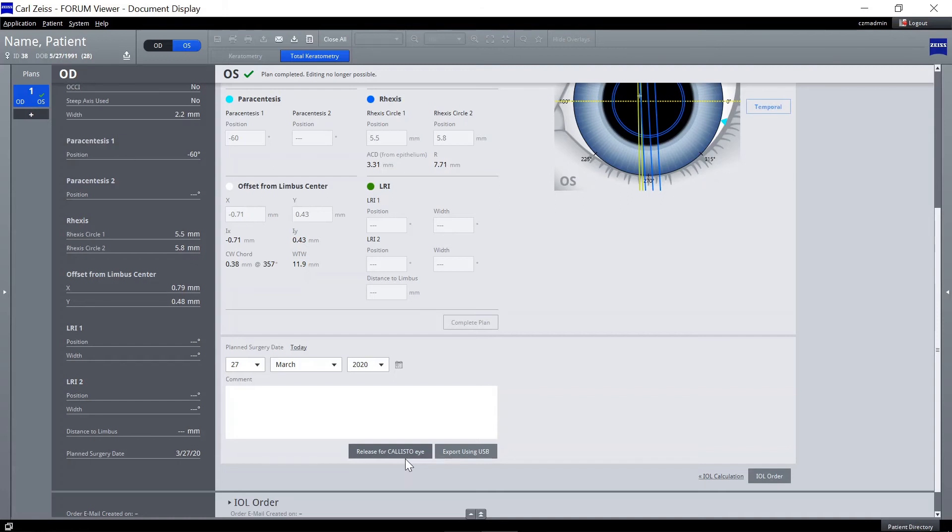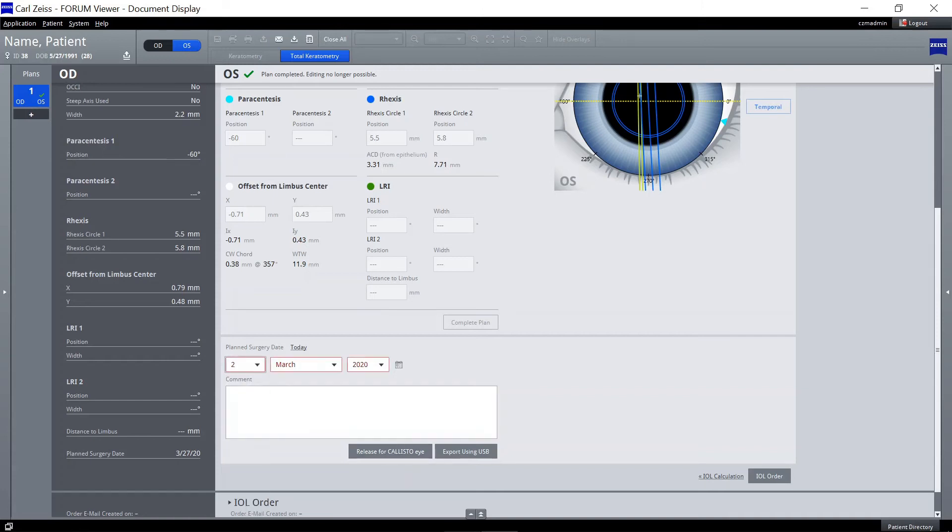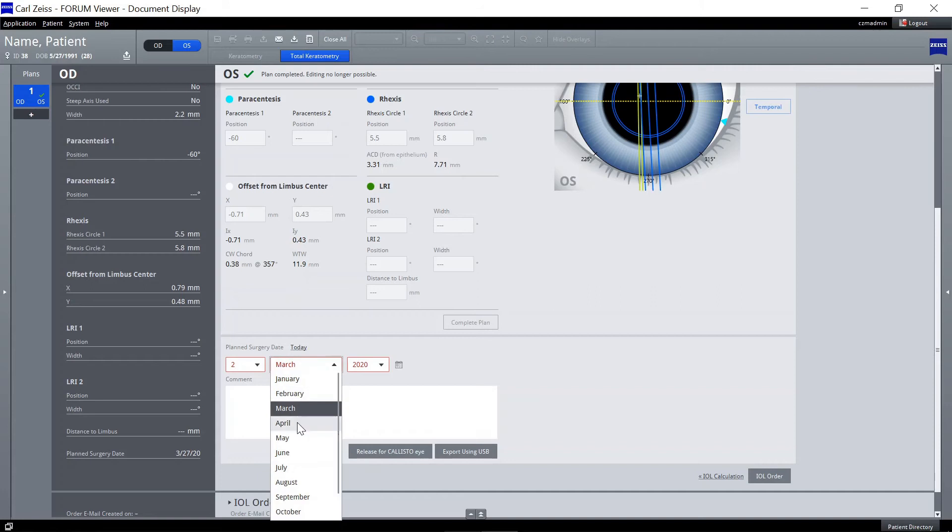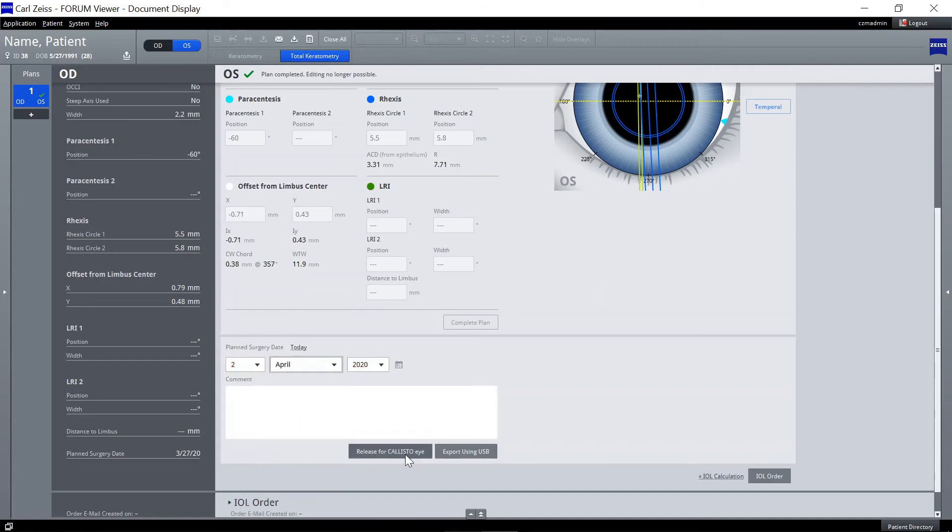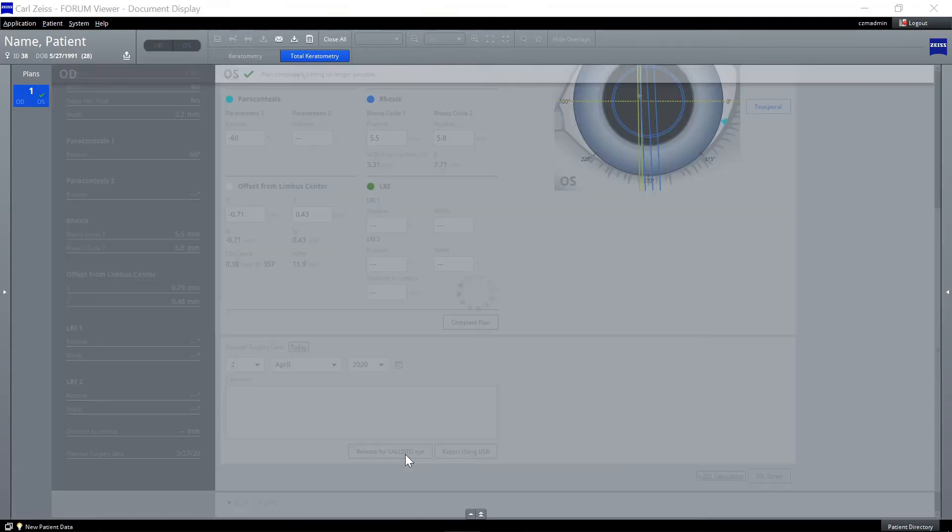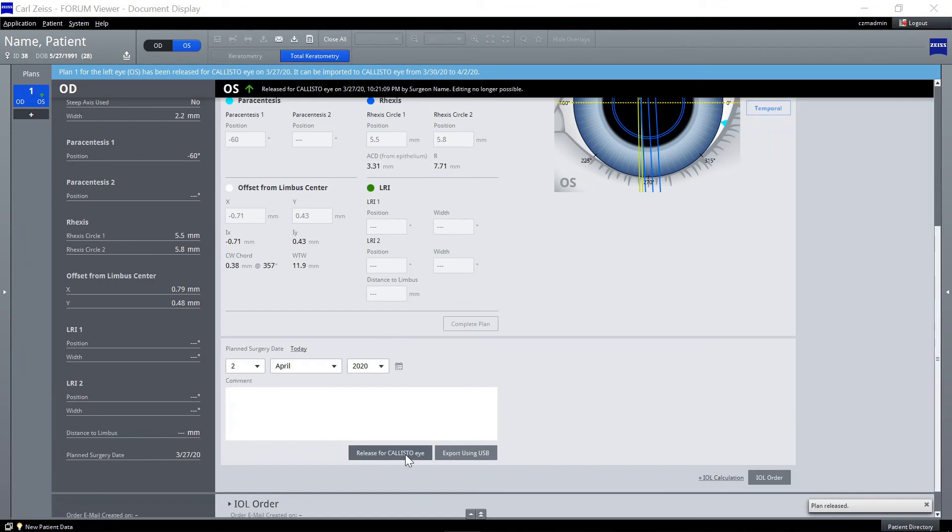To release the plan for surgery, set the surgery date and click on Release for Callisto Eye. The plan is then available for import on Zeiss Callisto Eye three days in advance of the planned surgery date.